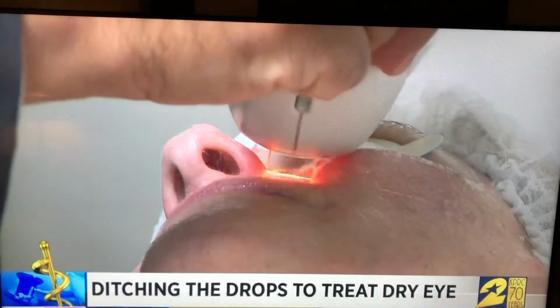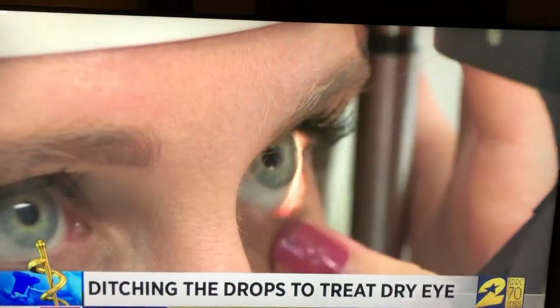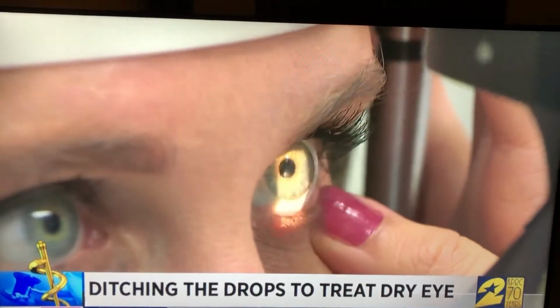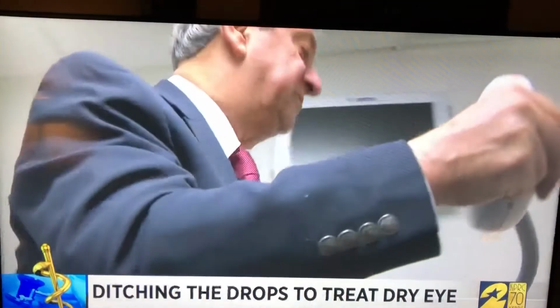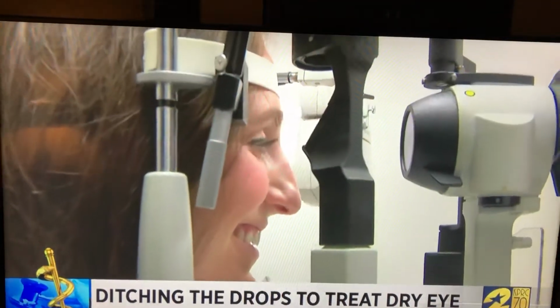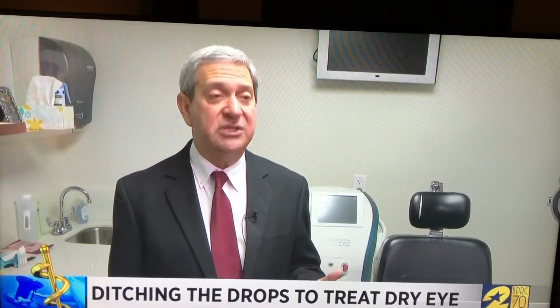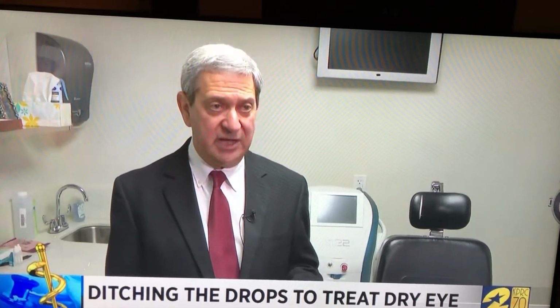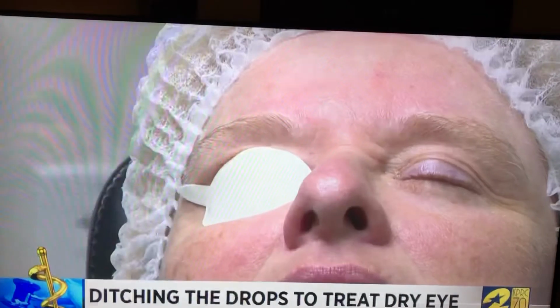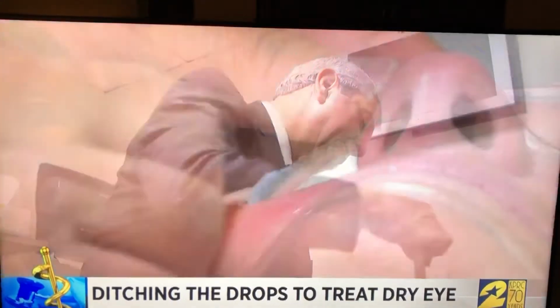It was first used to treat skin issues like rosacea, to close tiny blood vessels that feed inflammation to the eye. And Dr. Alan Panzer says when patients started claiming their dry eyes improved, doctors began to do some research. Those vessels are feeder vessels. They feed the inflammation to the eye, and by closing them, we decrease the inflammation to the eye. Then decreasing the inflammation to the eye makes their eye feel better. And so a new dry eye treatment was born.